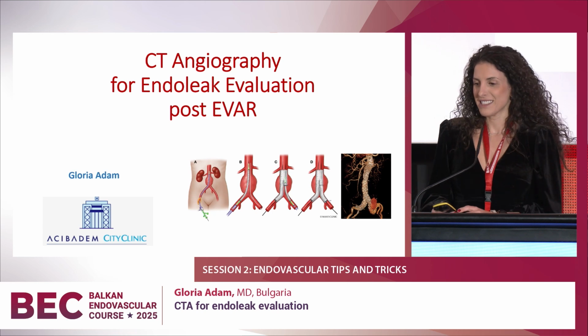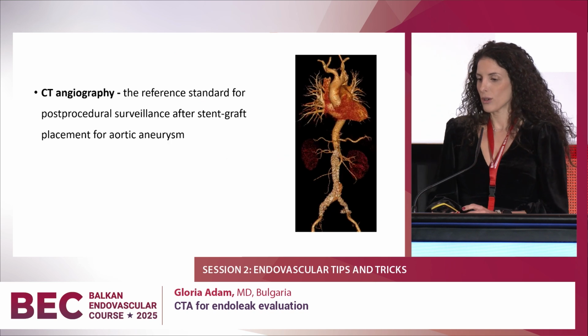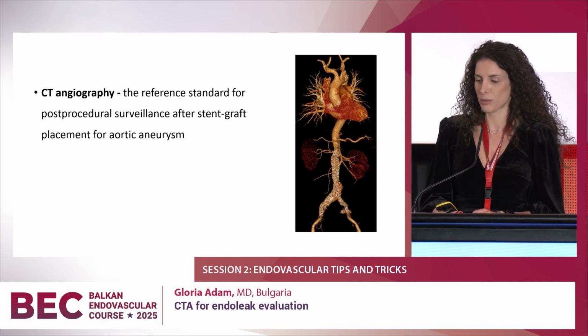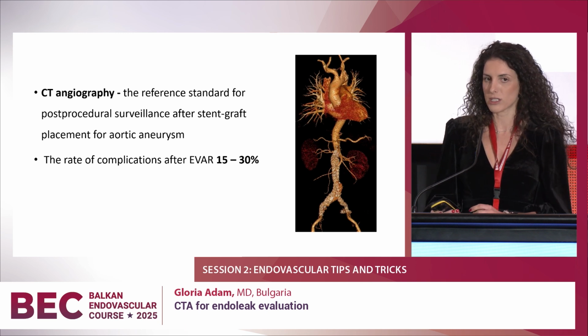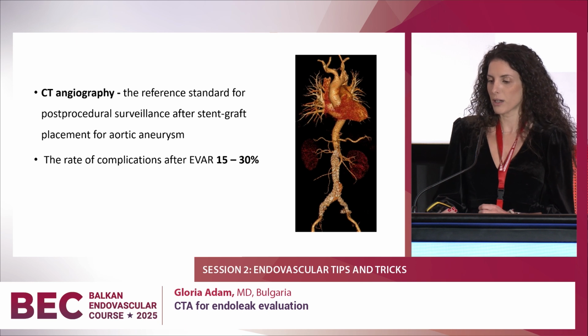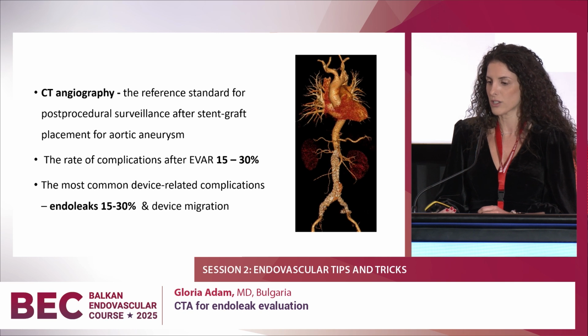Okay. My topic is CT angiography for endoleak evaluation post-EVAR. You know, CT angio is important both previous and after the procedure for aortic aneurysms. The rate of complications actually is 15 to 30%. EVAR is really with lower morbidity and mortality compared to surgical repair, but there is the risk of complications and the need for follow-up. The most common device-related complication is endoleaks, 15 to 30% again, and device migration.